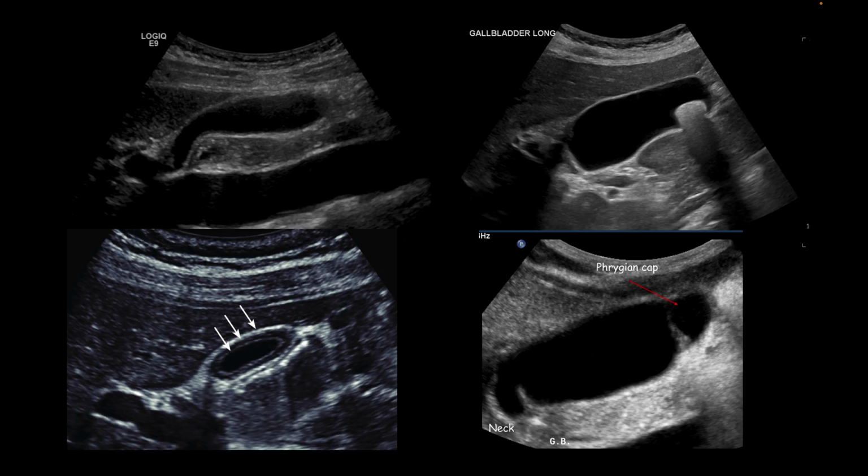Now go through a few normal variants here. So the top left of screen, this is a clearly normal gallbladder. You can see it in nice long axis, and you can see the neck diving away down towards the porta hepatis, and that is a nice view. You'd sweep through that in 2 planes to make sure, yes, it is indeed normal, but that looks like a nice, normal, healthy looking gallbladder.